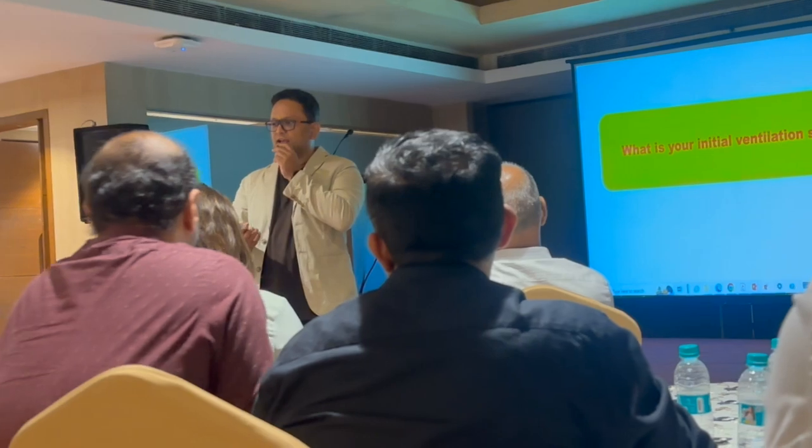What about you, Dr. Sumera? I think what you define as a low tidal volume in ARDS is definitely different from what you otherwise see. So I personally, when I do the ventilator settings, I don't just look at tidal volume. I also look at how the patient behaves in terms of P-plat and other parameters. But we will talk about P-plat. Just to simplify, what should be your initial? I start initially with 8 mls. Now, Dr. Balla is from the old times because I am sure he must have been using 12 mls per kg in your time. No, that's true. Yeah, in our time, it was 10 ml per kg. 12? Then 10. Okay.